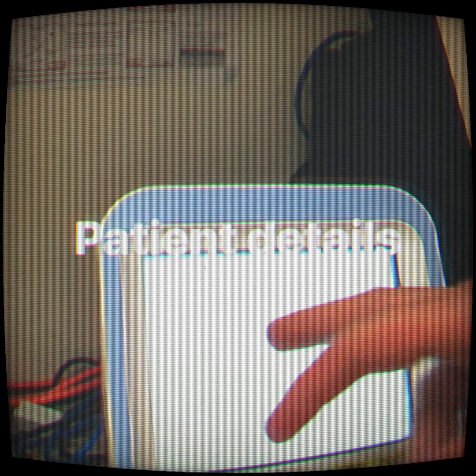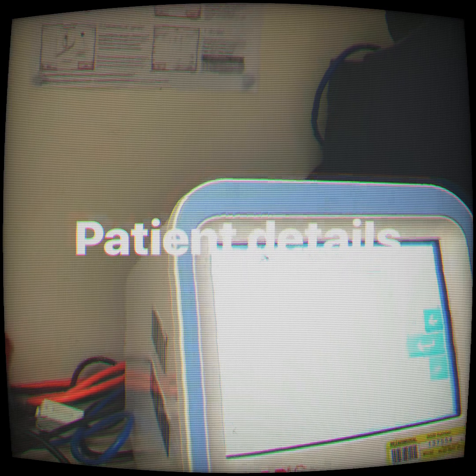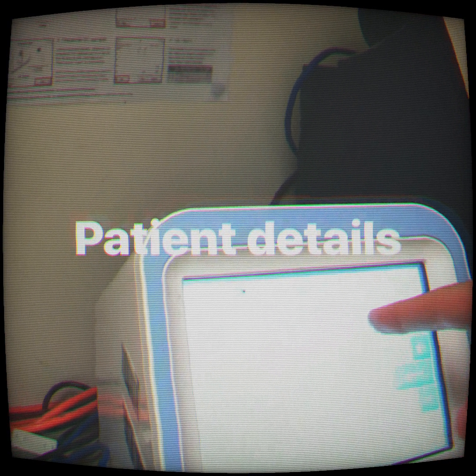Now you need to do a new test. Enter the patient's details with the plus button — the patient's MRN, which is a 10-digit number.